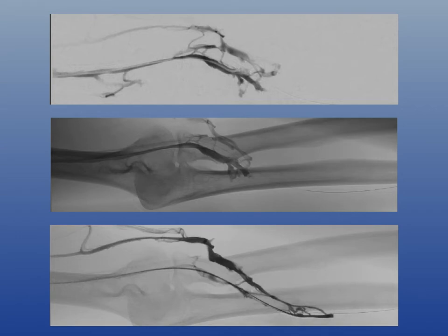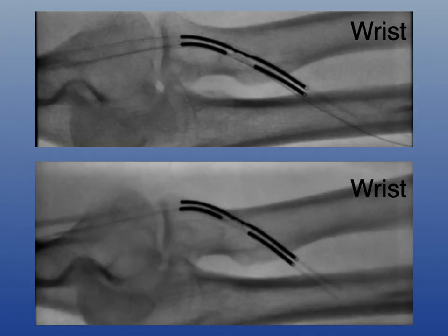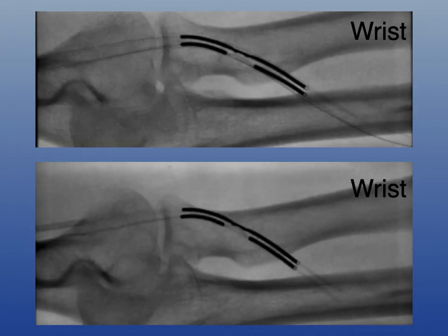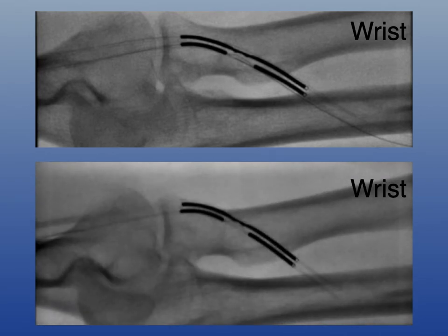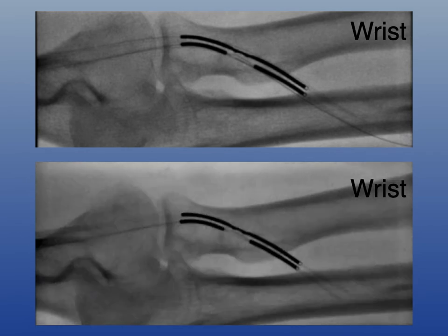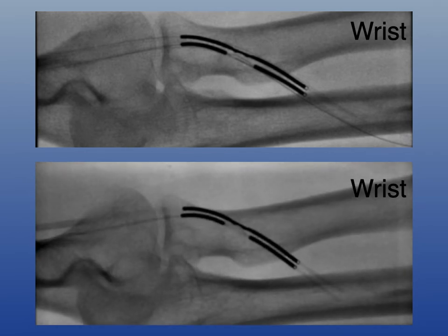Once I was there, with a catheter in place, the initial venogram showed some bridging veins, a perforating vein, a dominant median cubital vein, and flow out the cephalic vein. Once I confirmed access into the proper ulnar vein, I advanced the electrodes. The magnets allowed them to align. I then double-checked positioning — the white squares at the distal part of the electrodes help ensure no parallax with the C-arm, and I confirmed the distance between the two devices was less than two millimeters, verified at ultrasound.